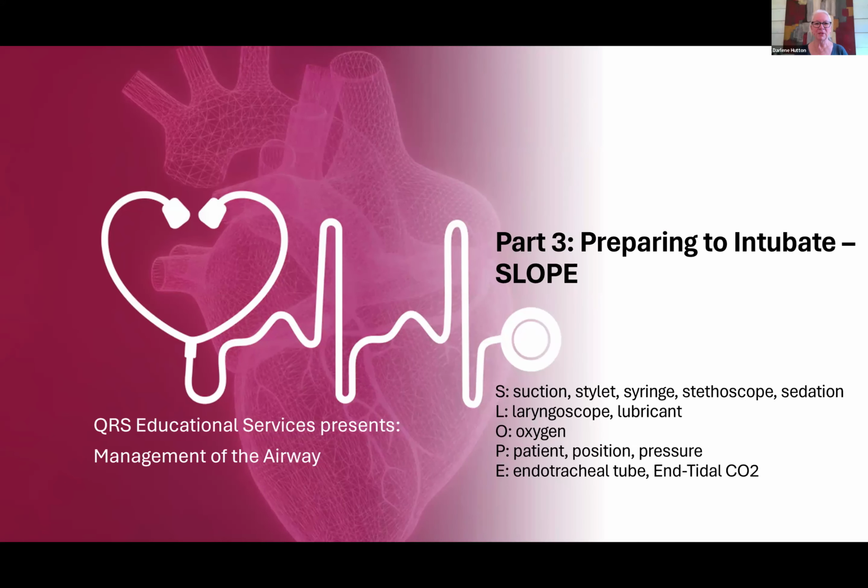Hi, everyone. I'm Darlene Hutton with QRS Educational Services, and this is part 3 of a 7-part series called Airway Management. It's been designed for nurses, and in this video, we'll be looking at what we need to get ready to assist with intubation.